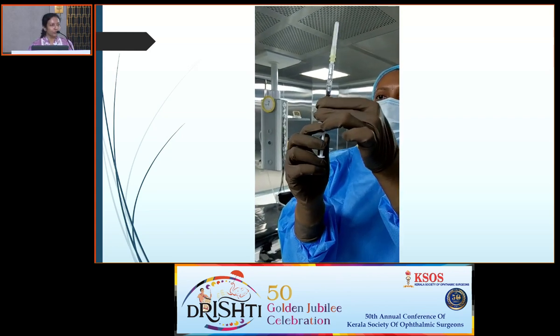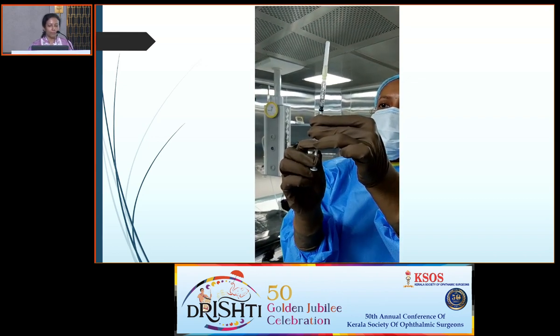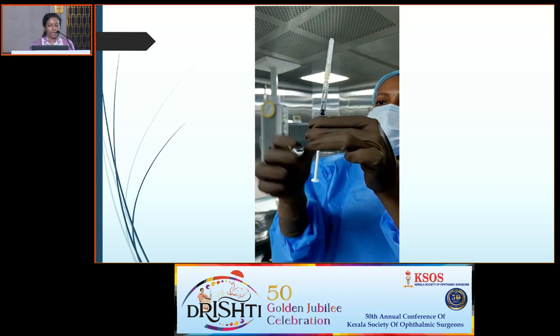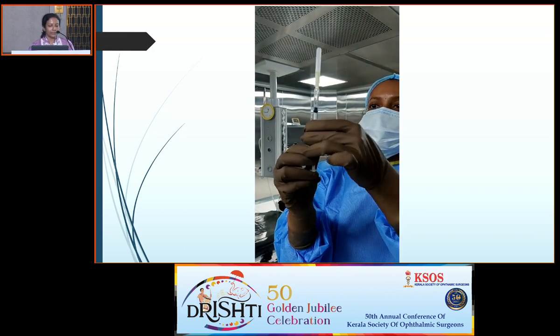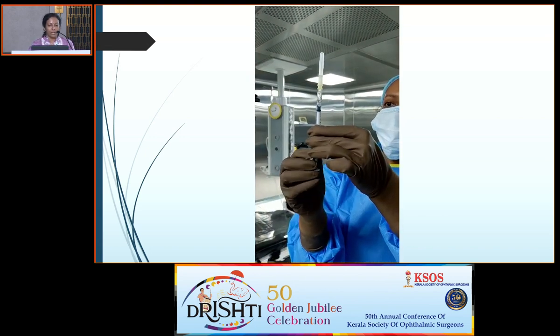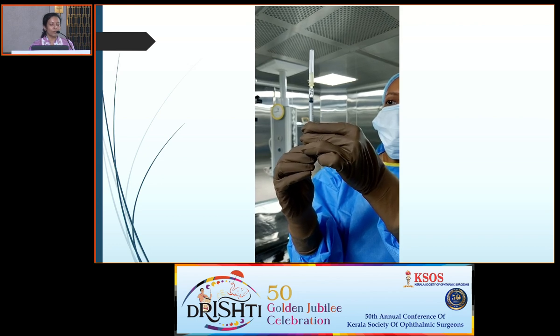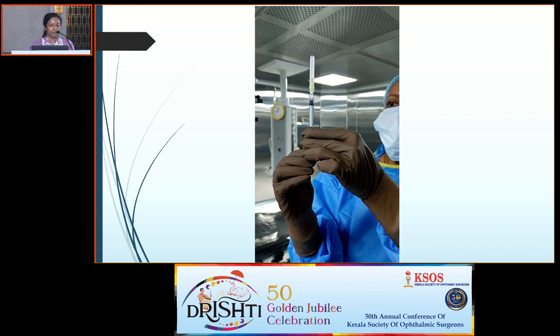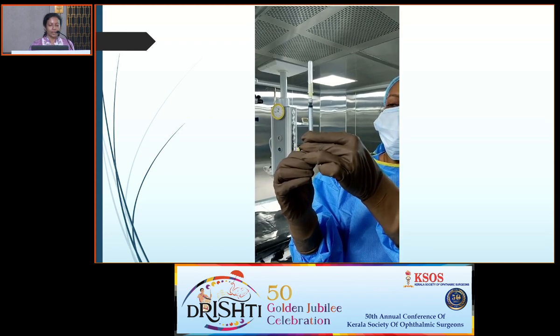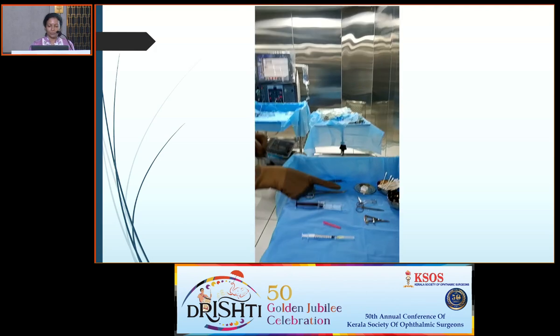Give it a tap to remove the air columns, and then slowly push and pull so that the entire air inside is removed. And in between, I keep pressing the 30 gauge needle so that sometimes it becomes loose and it falls off. Then slowly inject it and make it into the desired quantity of 0.05 ml. So now the injection is ready, and I place it on the tray.